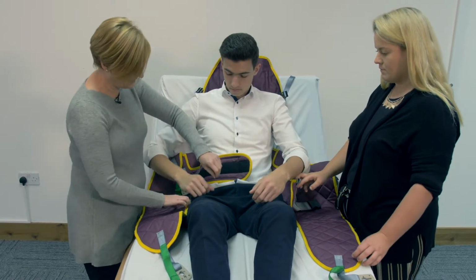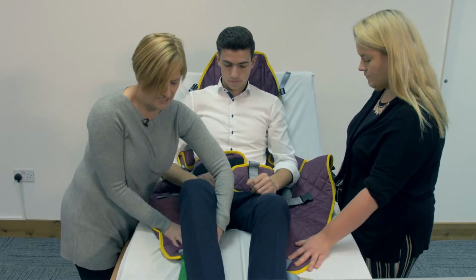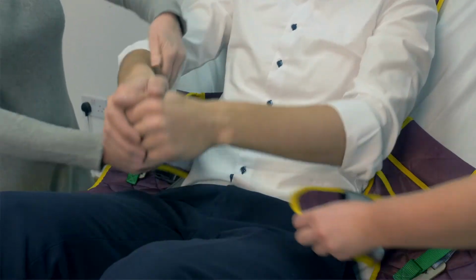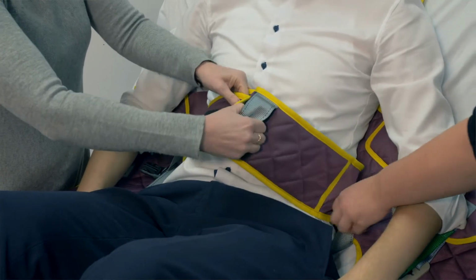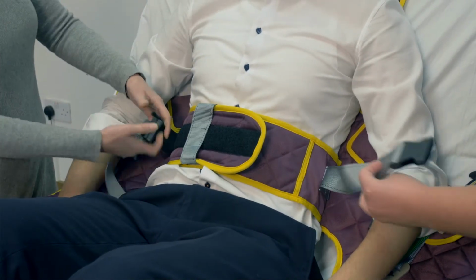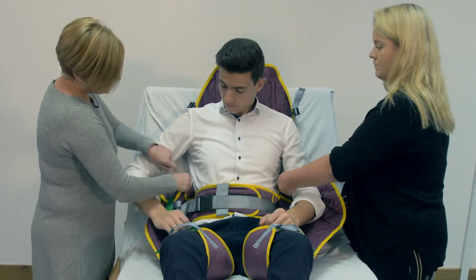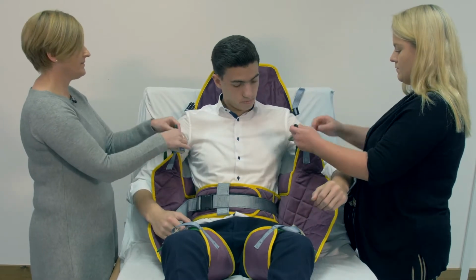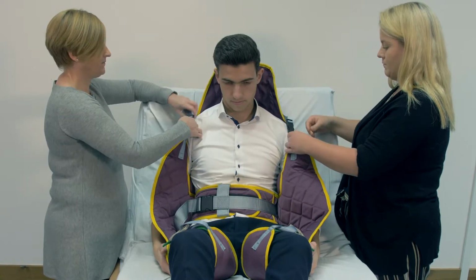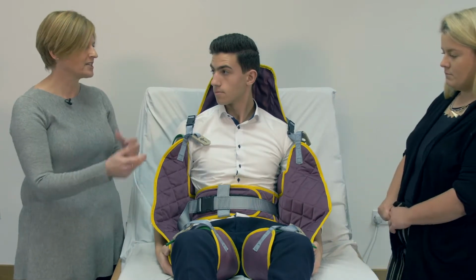Once the sling's in position behind the user, then we can bring the leg channels round and the chest strap and fit those round. So positioning the leg channels under each thigh. We then need to fit the chest strap with the Velcro. And fit the clip belt over the top. Then the padding comes under the armpits and we fit the head support with the clips. And then we can bring the hoist in to actually hoist up off the bed.